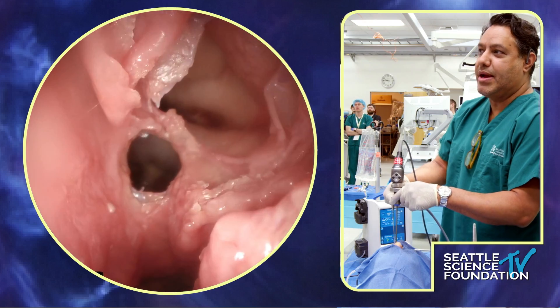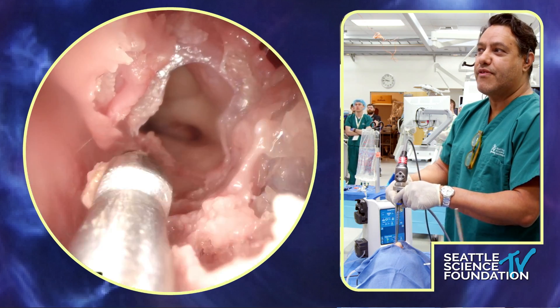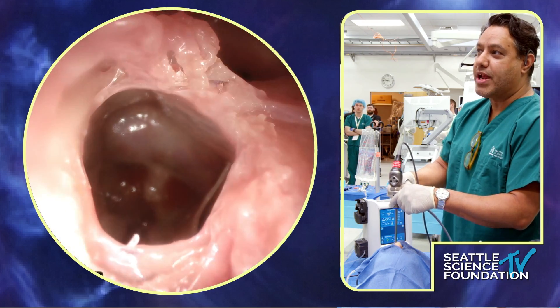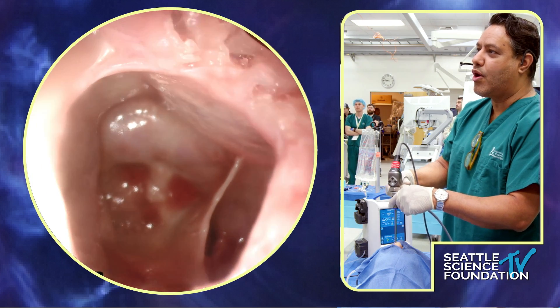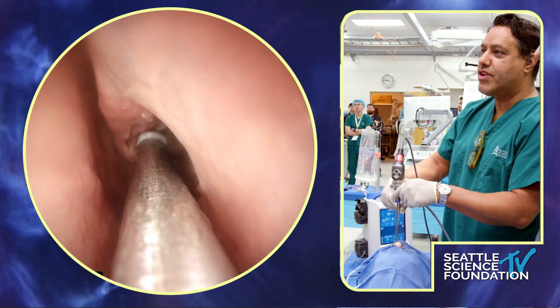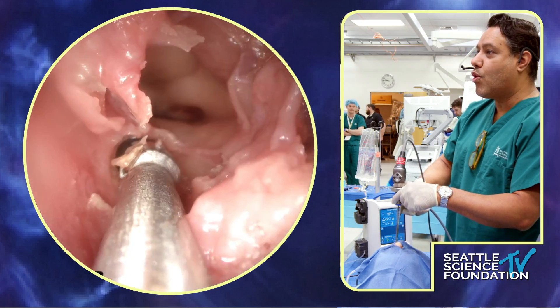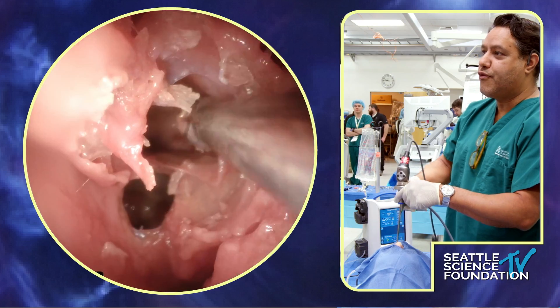When operating with residents and fellows, I often ask them when they think they're done — it depends on the goals of the surgery. If this is not polyps, maybe that's a big enough opening. Looking in here, you can see the pituitary or the sellar face — the bone over where the pituitary lives. That partition is likely going to the carotid canal on the left. We could take this sphenoidotomy all the way over to the orbit and take down this entire superior plane if we wanted to.